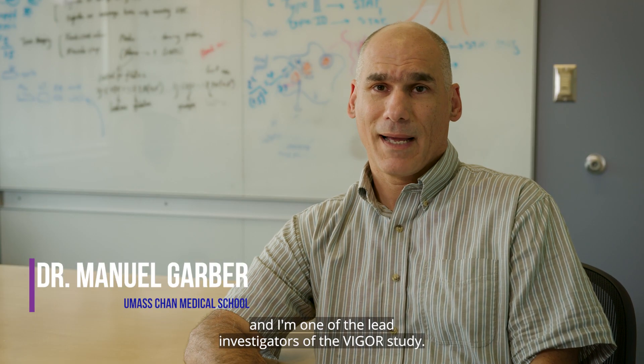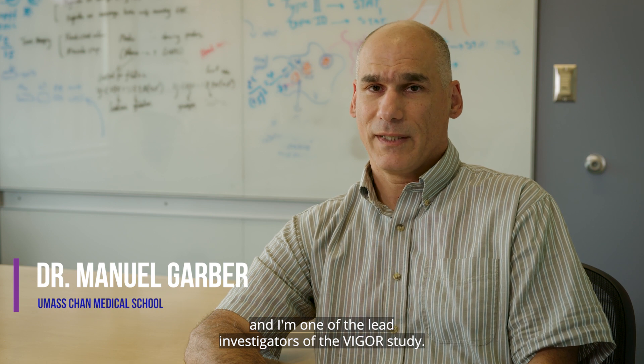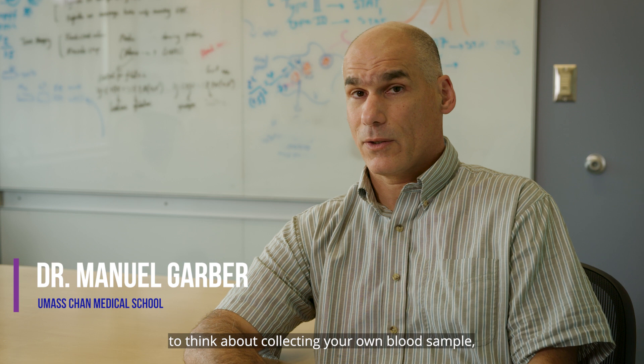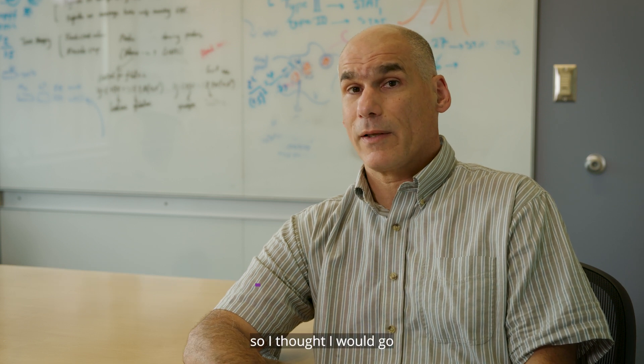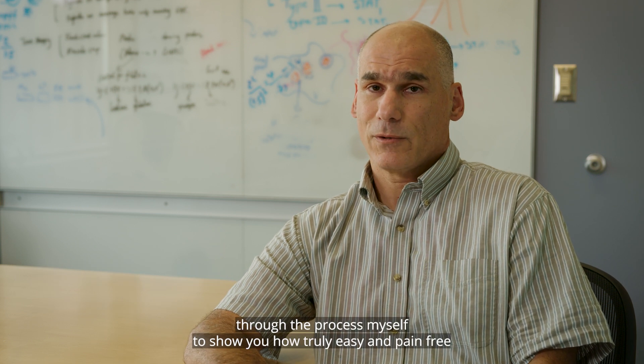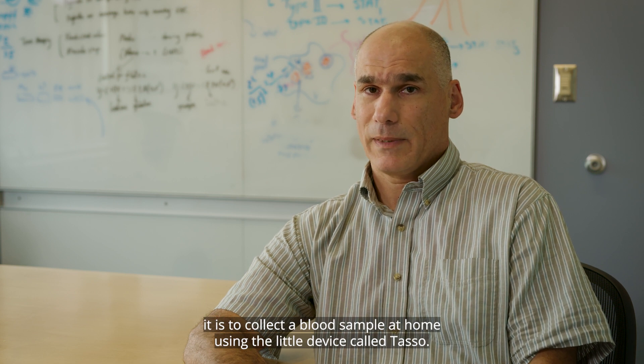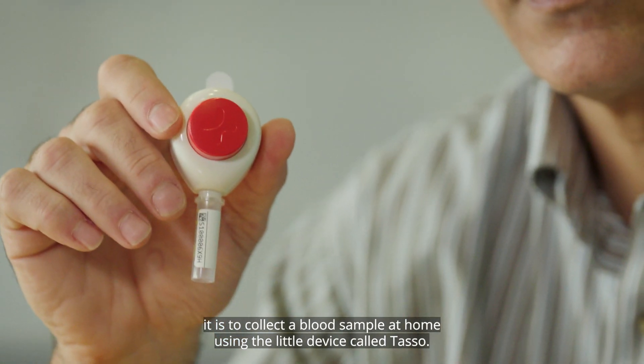Hi, my name is Manuel Garber and I'm one of the lead investigators of the VIGOR study. I know it may sound a little scary to think about collecting your own blood sample, so I thought I would go through the process myself to show you how truly easy and pain-free it is to collect a blood sample at home using the little device called Tasso.